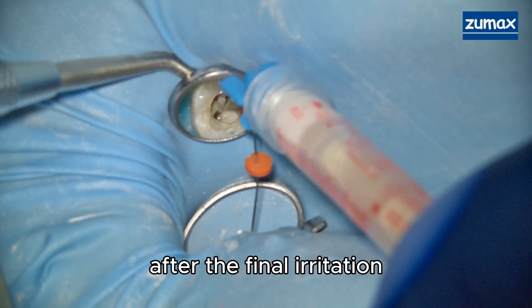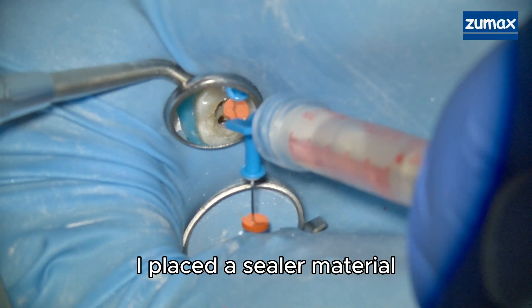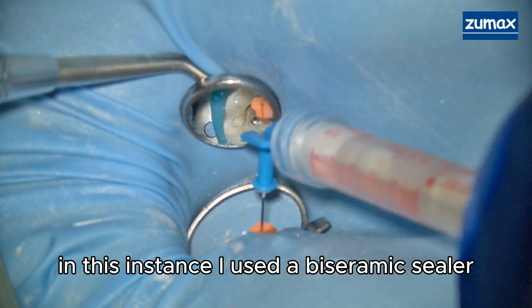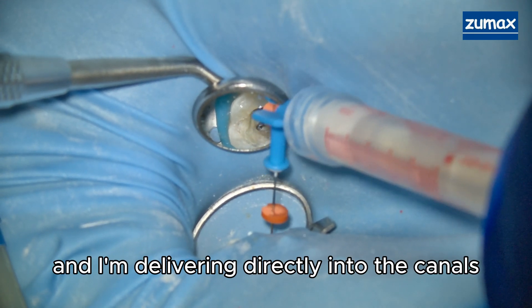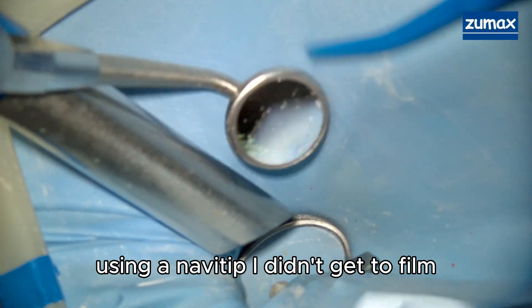After the final irrigation, I placed a sealer material. In this instance I used a bioceramic sealer, and I'm delivering it directly into the canals using a nice tip.